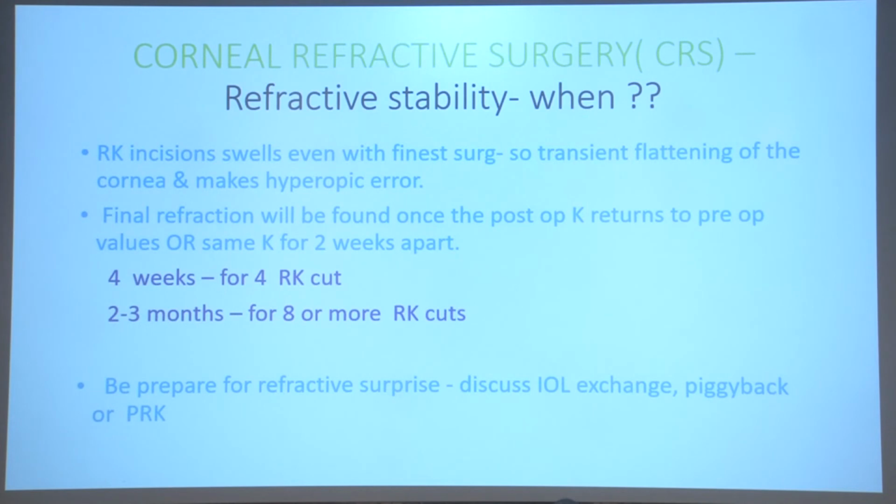Refractive stability: post-surgery, if you have done a cataract surgery on a patient with RK and you want to actually measure the refraction, what is a good time? Minimum 4 weeks for 4 RK cuts and at least 2 to 3 months for 8 RK cuts. And post that only you will be able to say that this was a post-surgery refraction. Always be prepared for refractive surprise, but more important is to keep the patient prepared for a refractive surprise, not only you.